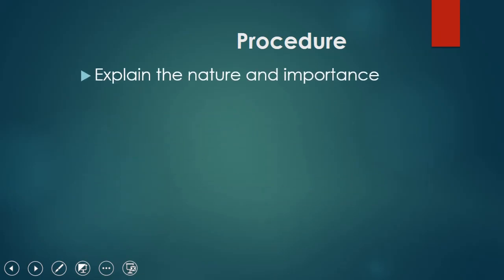As part of our procedure steps, the first and most important step is for you to explain to the understanding of your patient what you are coming to do. This is not the usual way of taking food. So the patient, if conscious, or even if unconscious, their relatives may become apprehensive because they would not understand why food would have to be given through the nose.